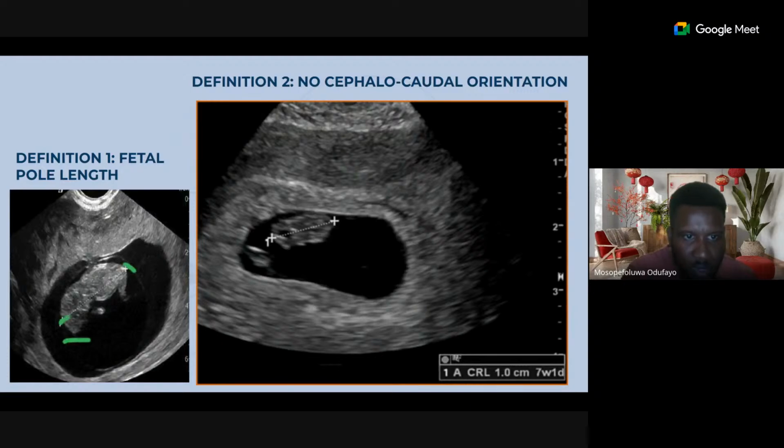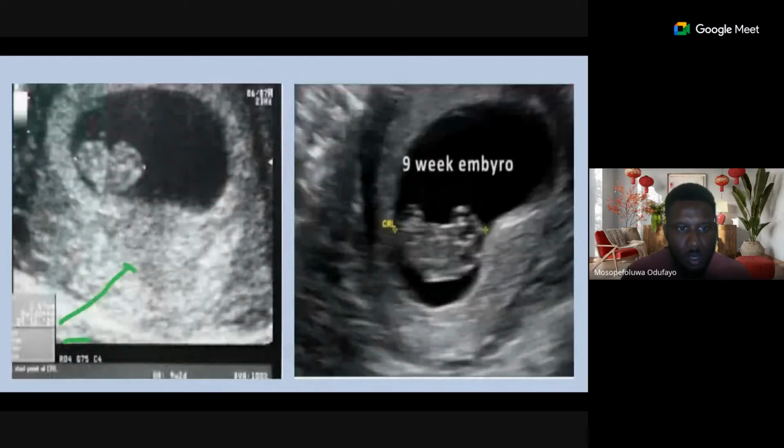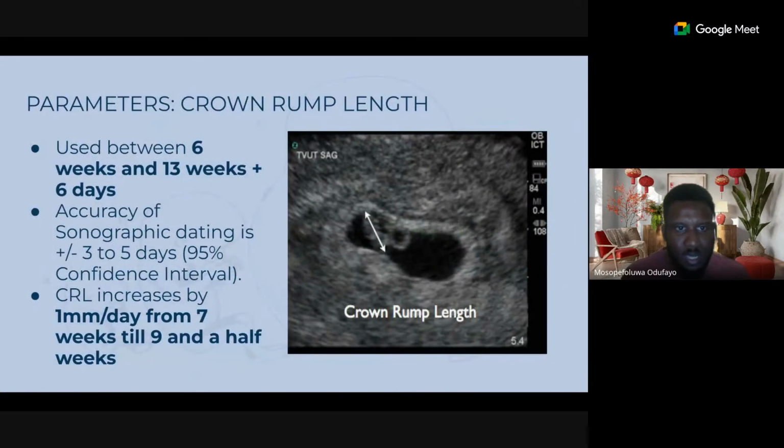So we can take the well-differentiated cephalocaudal regions. But contrast it with this one. I don't know where the head is. I don't know where the bum is. So what I do is I rock my probe until I get the longest axis. And there we have it, the CRL. Is that okay? Good. Then that's it again. This is another CRL. We can't really tell where the head is. We can't tell where the bum is. Take the longest axis. That's what's going to give you the CRL in these two places. We can see that.